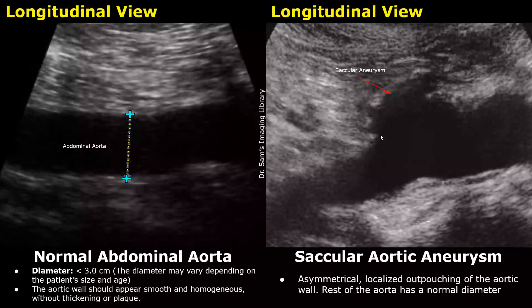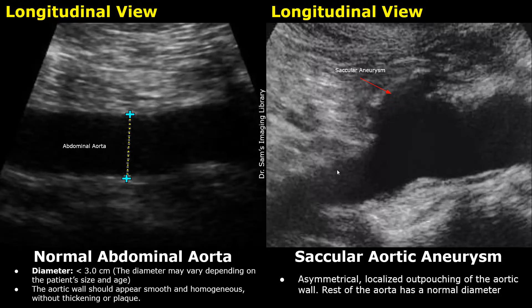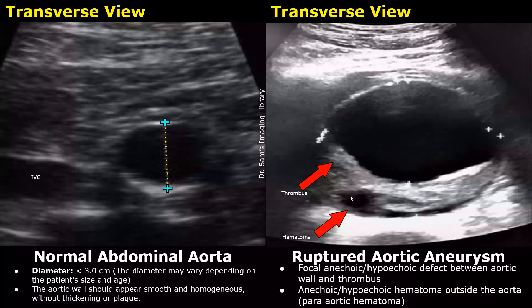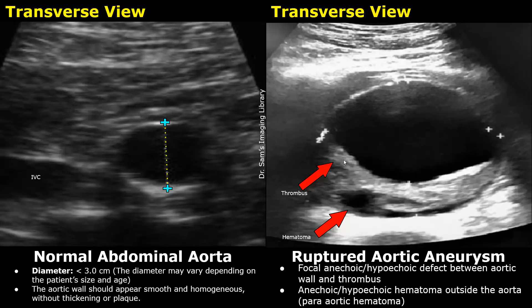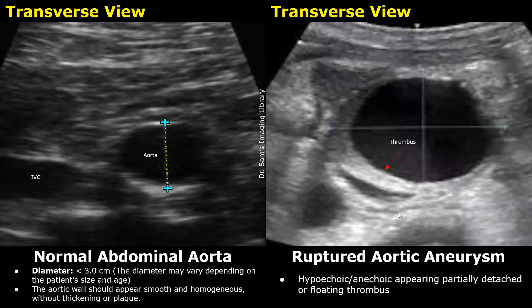A saccular aortic aneurysm is less common. It is a focal, asymmetrical, localized enlargement of the aortic diameter, while the rest of the aorta has a normal diameter. If an anechoic or hypoechoic area is seen just outside the dilated aorta, it indicates a ruptured aortic aneurysm. This anechoic area is a focal defect between the vessel lumen and the thrombus — this is an aortic rupture, a surgical emergency. Here is another case showing a ruptured aortic aneurysm with a focal hypoechoic defect behind the thrombus, which is a strong indicator of rupture.